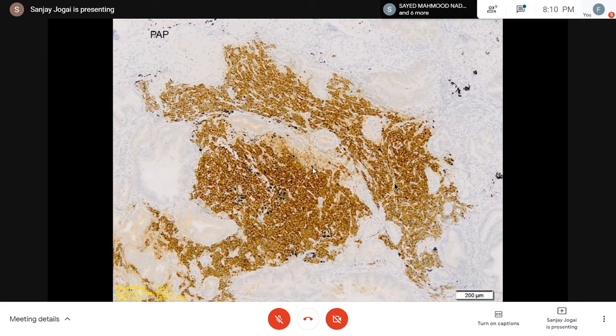I have posed these questions to people like Andrew Nicholson at Brompton and John Gosney in Liverpool, and they said the same thing. They said in most situations, TTF1 sorts it out. So that was the reason I was saying people are not big fans of Napsin. But in America, a lot of people use Napsin.